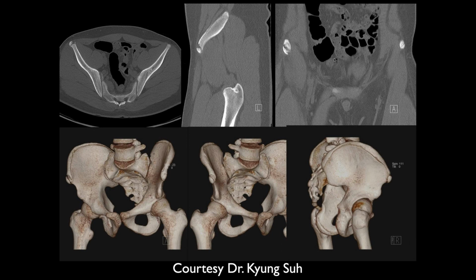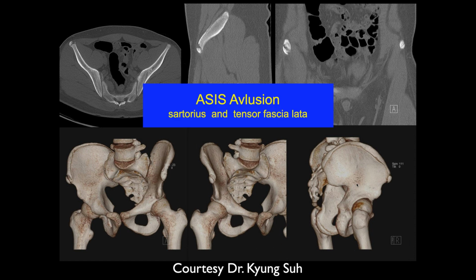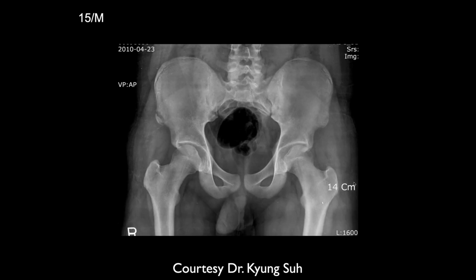Okay, so on the CT scan, we see a small, mildly displaced fragment coming off the anterior iliac bone, the superior iliac spine. So there's concern for an avulsion fracture. That's probably the Sartorius. Ashu?